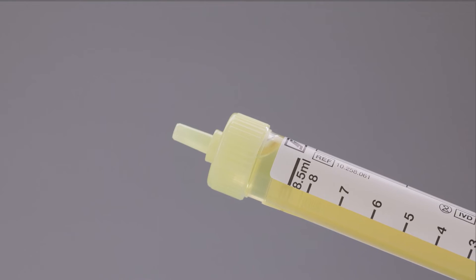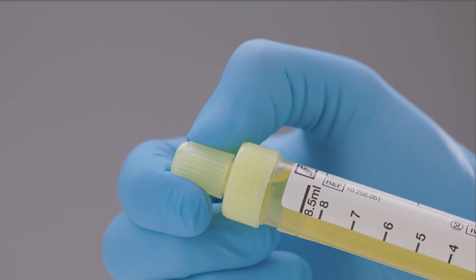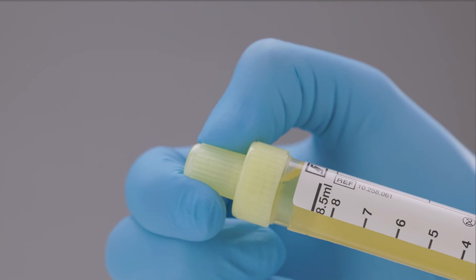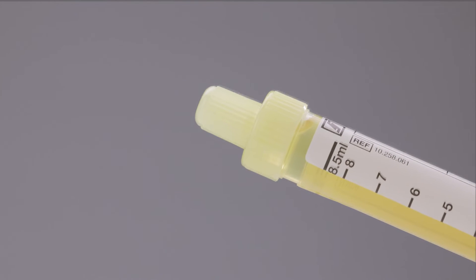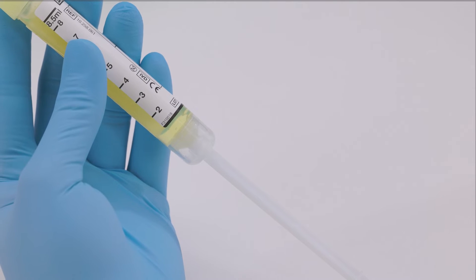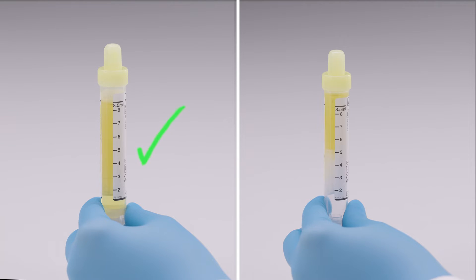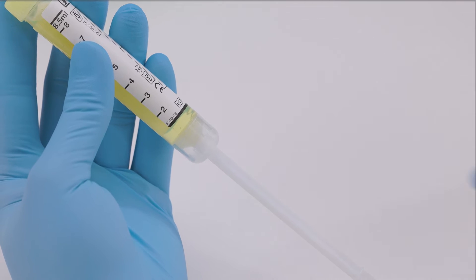Turn the urine MonoVet upright so that the tip points upwards and close it securely using the stopper you previously set aside. Make sure not to leave a gap between stopper and screw cap. The piston rod needs to be pulled completely to the bottom of the tube during sample collection so that it breaks off easily. This also avoids insufficient urine volume in the tube. Break off the piston rod.